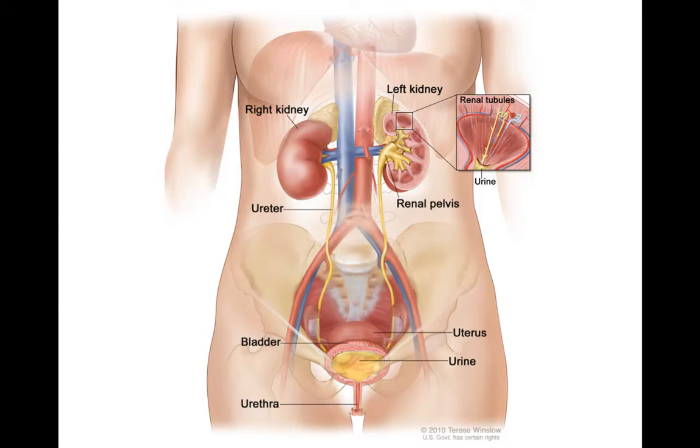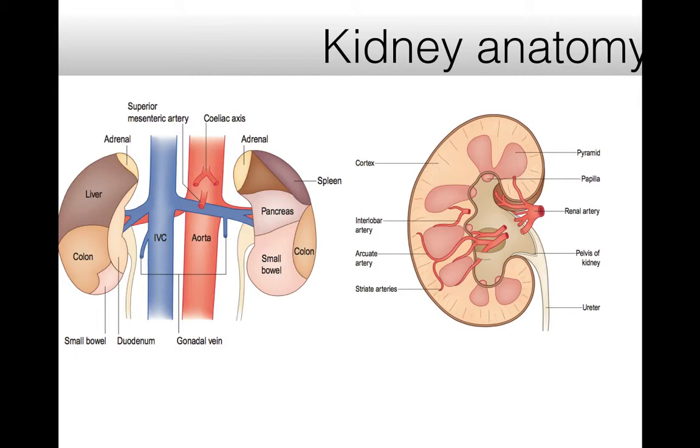My experience is that it will be easier when you encounter hydroureter. It will be easier to scan the upper third part. For the lower third part, because it travels down to the pelvis, it will be difficult for me to scan that. But for the upper part, I have a 90 to 95% success rate to identify the obstruction place and site.